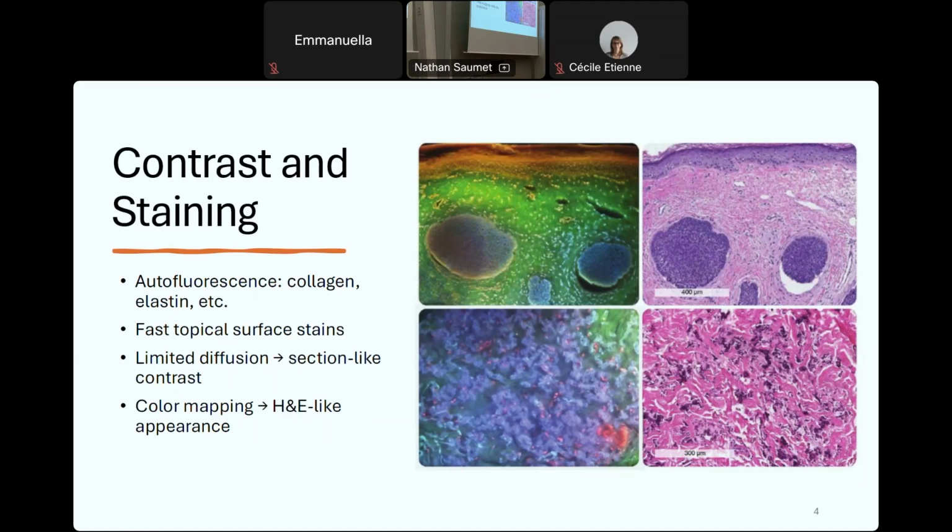The only issue with the fluorescence image is that we can see new cells and new things that pathologists are not able to understand. So there is a need to re-educate people in order to have a better understanding of the staining protocol and the fluorescence emission.